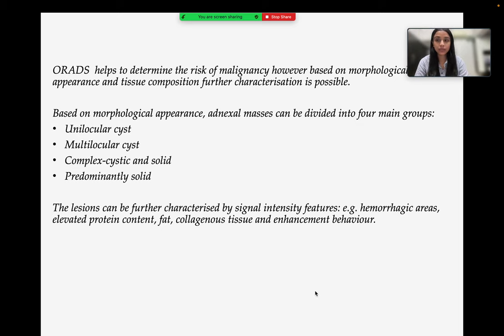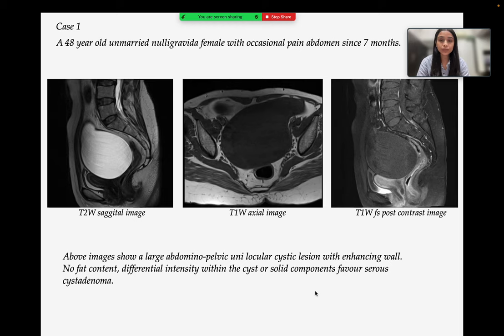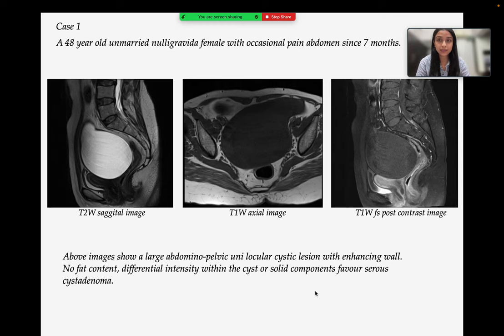Case 1 is a 48-year-old unmarried nulligravida with occasional pain in abdomen since 7 months. The images show a large abdominopelvic unilocular cystic lesion with enhancing wall. There is no fat content, differential intensity within the cyst, or solid component, which favors serous cyst adenoma.